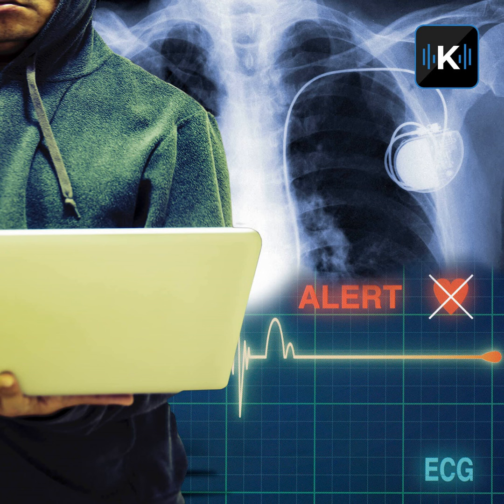So this is Bo. He's been having chest pain intermittent for about the last week. All right, let's give him 20 of cardizem. All right, we're going to be giving you some medicine continuously through your IV, okay? This should really get you feeling better. Okay. How you feeling, sir? I'm getting really lightheaded.